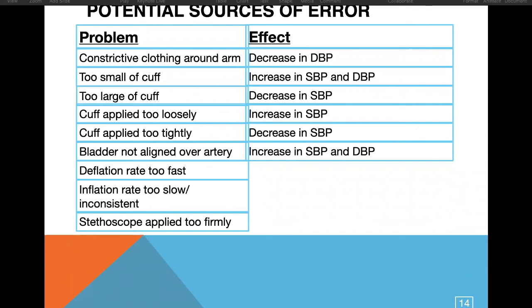If we deflate the cuff too fast, so that needle comes flying down the dial, then we're not going to catch where those numbers should be. We won't hear it until the needle's already past that millimeters of mercury where it actually is.